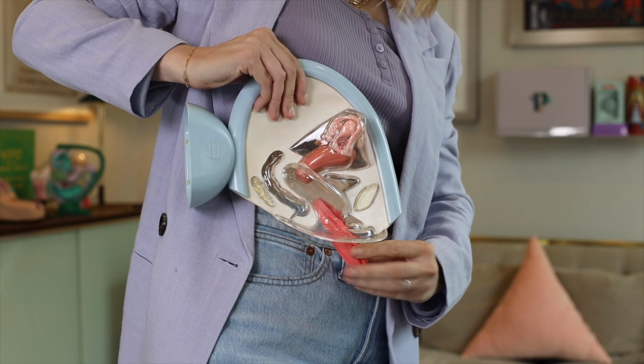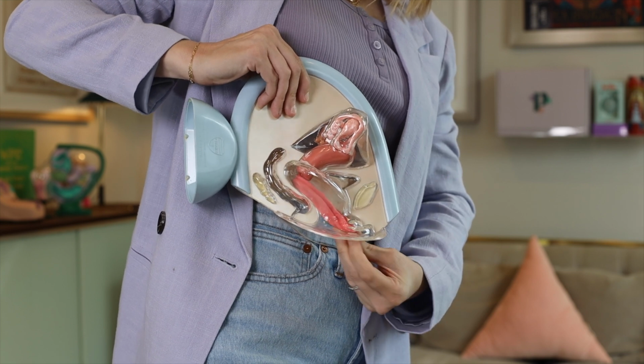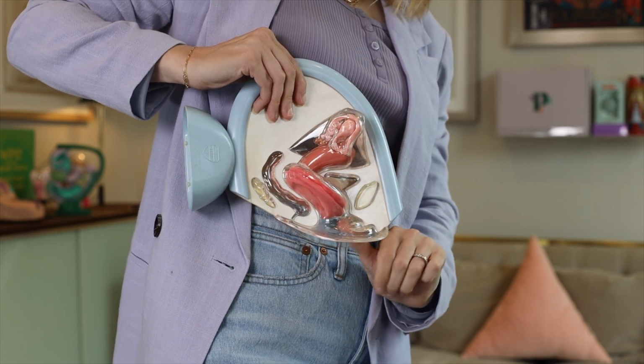One of the reasons people fail so often with menstrual disc insertion, it's not that they didn't do it right, it's that they assumed they did it wrong and they were actually overthinking it. So I've had people message and say it can't be that easy, and I'm like, it actually could be that easy. Just wait and see. Wear backup, right? You don't know if it's leaking until it leaks, so always wear backup. But yeah, you fold it and you just put it in, and angle it towards your back. I have lots of videos on how to insert these things, and they nestle right up to where they need to go. You tuck the last part in, the front rim, which is the bottom as you insert it, you tuck it up, and that's it.